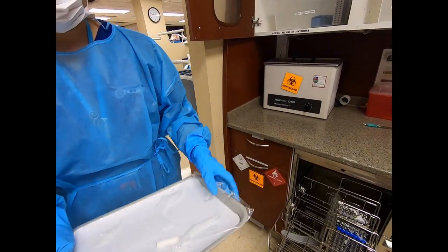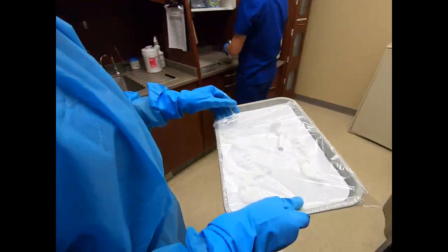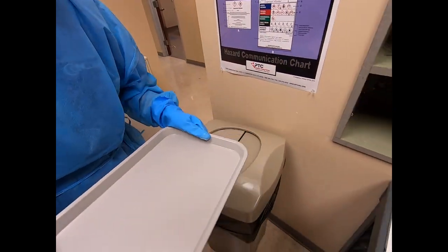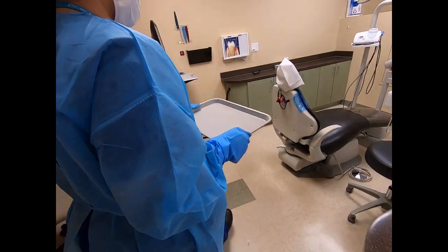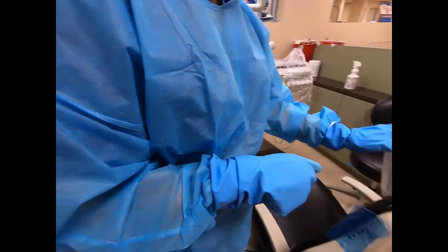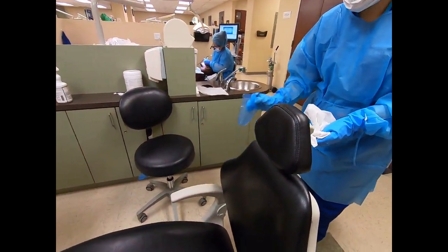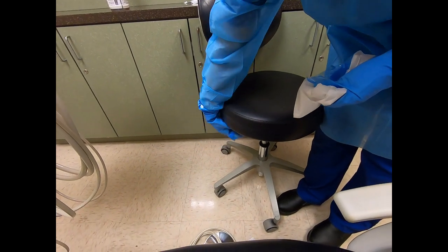Remove the barrier from your tray and place it into the trash bin in the sterilization area and return the tray to your operatory for disinfection. When you return to your operatory, collect all barriers and load onto bracket tray barrier. Once this is full, pull bag up and dispose of the bag into the trash.